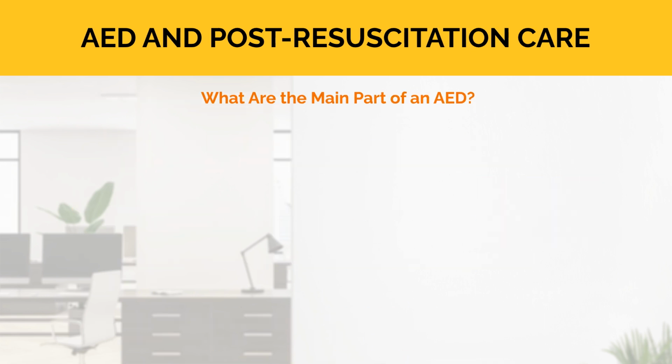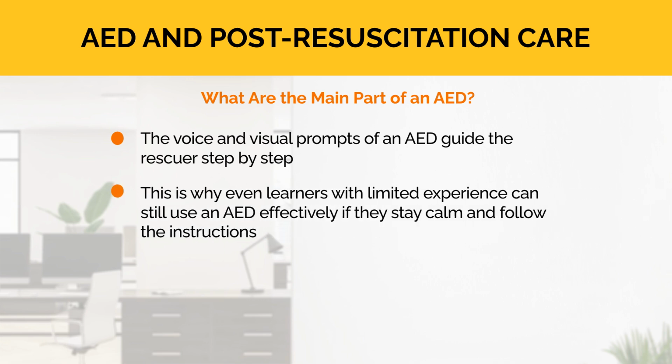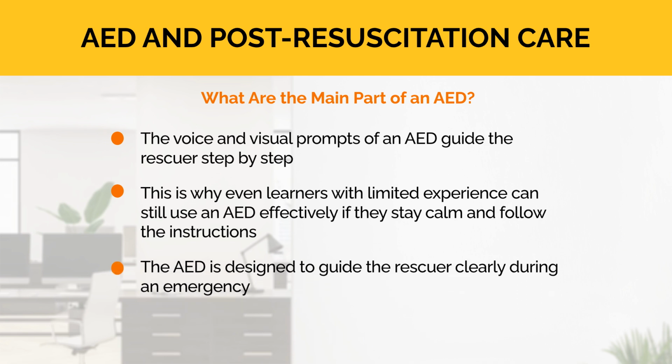Now, what are the main parts of an AED? The voice and visual prompts of an AED guide the rescuer step by step. This is why even learners with limited experience can still use an AED effectively if they stay calm and follow the instructions. The AED is designed to guide the rescuer clearly during an emergency.